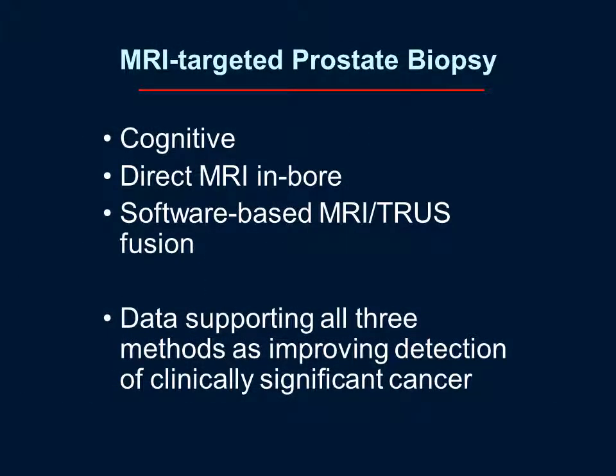So the very final topic I'll cover more briefly in this talk is the MRI-targeted prostate biopsy. Really, three approaches to this have been described in the literature. Cognitive biopsy, so this is really using no specialized equipment. The biopsy operator looks at the MRI, gets a sense in their mind of where the lesion is, and then at the time of the biopsy, just on visual estimation, tries to take some cores from that area.